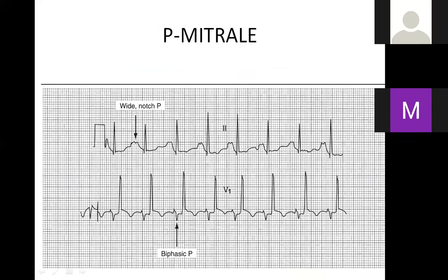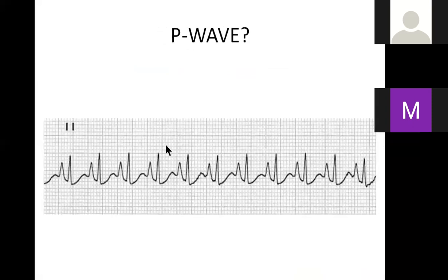Yes, P mitral. Yes. What is the diagnosis, friends? P is very tall. P wave, P pulmonale. Okay, very good. COPD. Just looking at the ECG, you can give the diagnosis that the patient is having COPD and some problem.